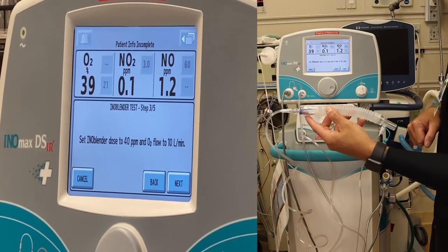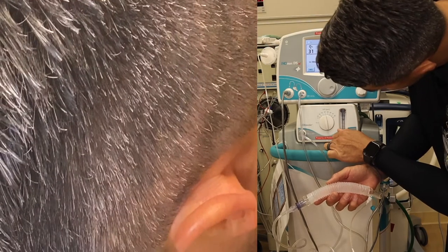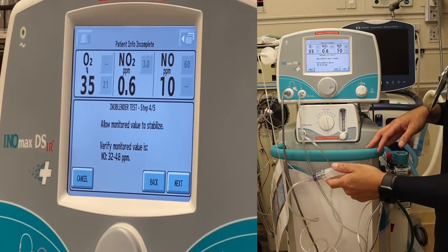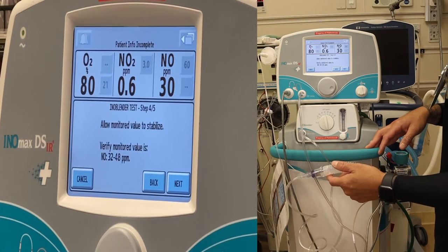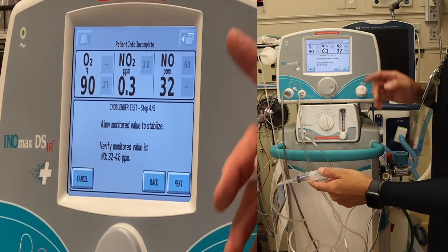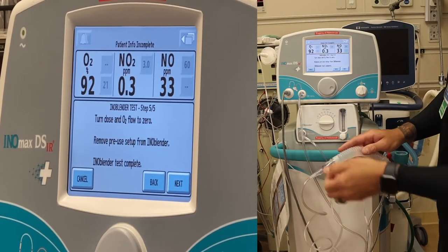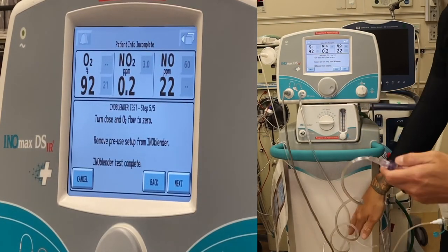Manually set the dose to 40 parts per million and 10 liters per minute using the blender. Turn to 40, turn up to 10, and press next. Watch values and wait for them to stabilize — looking for nitric oxide between 32 and 48 parts per million. We've reached 32, which is within range. Press next. Turn dose and O2 flow back to zero, remove the pre-use setup from the blender, and press next.